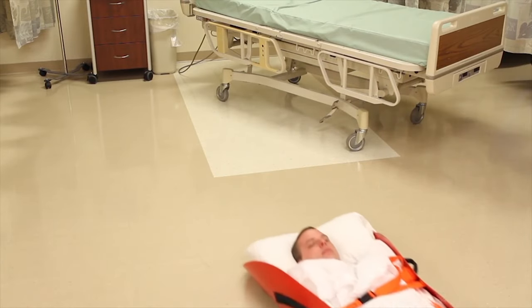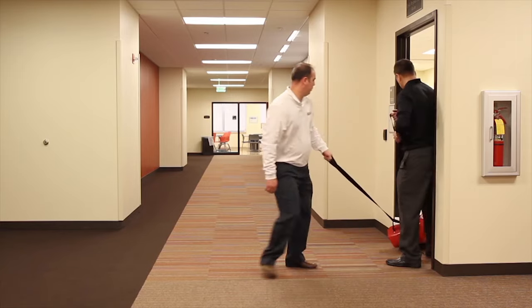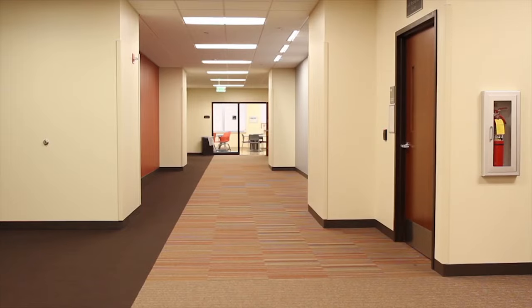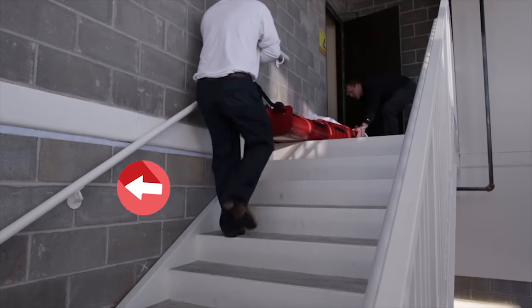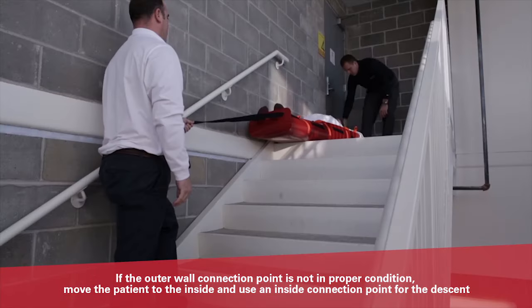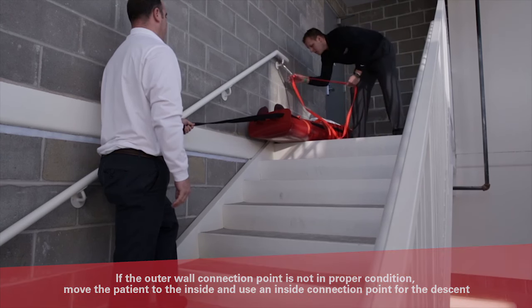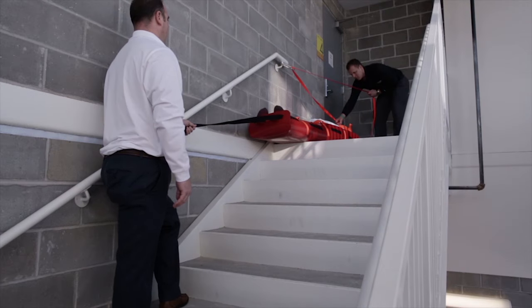Proper body mechanics are critical. Stand straight up, leaning away from the patient. Extend your arms fully and communicate with your partner so you are pulling together. Always face the direction in which you are pulling. The ideal position of the patient in the stairwell is along the outer wall, which typically gives the best connection point for the carabiner and makes the transition on each landing easier. Once the sender has properly positioned the patient, they will disengage the stairwell braking system at the head end of the sled and connect the carabiner to the highest anchor point at the top of the stairs.